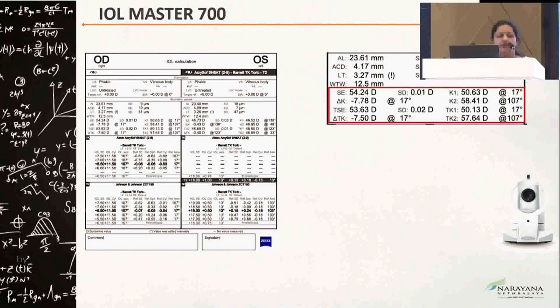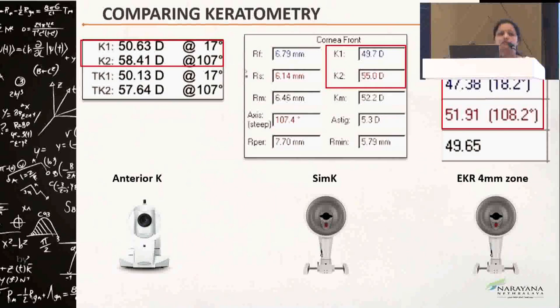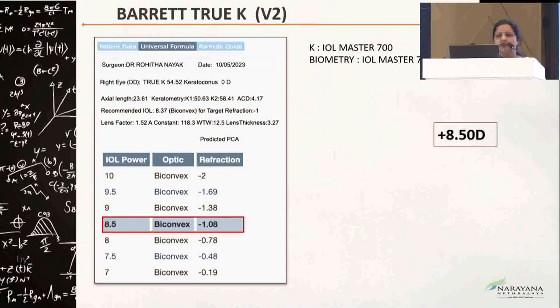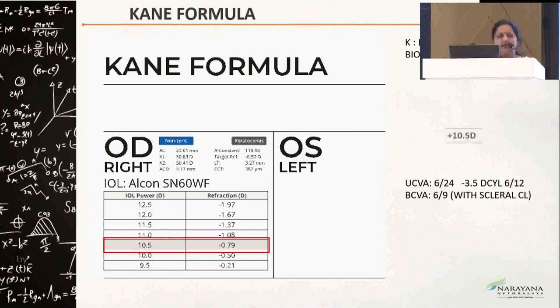So these are the comparisons: anterior K, SIM K, and the EKR. Barrett True K, using the anterior K from the IOL Master and the biometry, gives us a plus 8.5, whereas Kane, using the same parameters, gives us a plus 10.5. It is always better to go for a higher IOL power because it at least gives us a myopic target, or even if it overcorrects, it will give us a residual myopia, which is good. And any residual refractive cylinder can be corrected with the scleral contact lens, which the patient was already using.